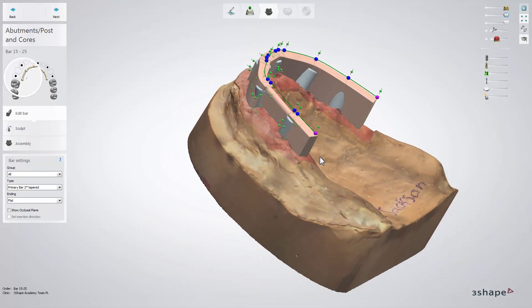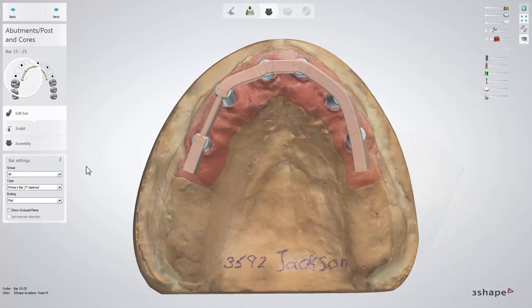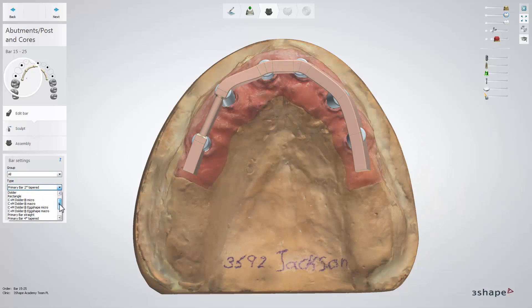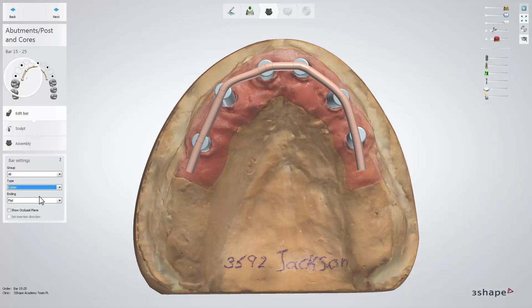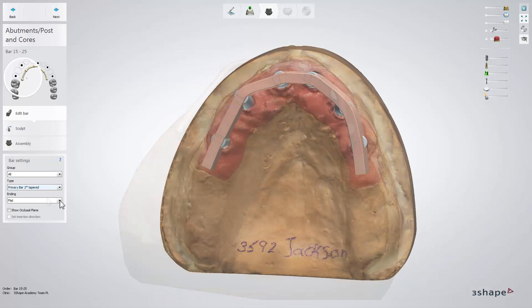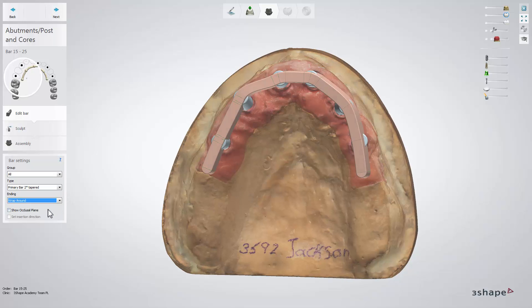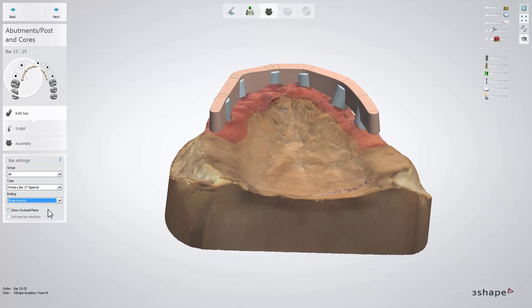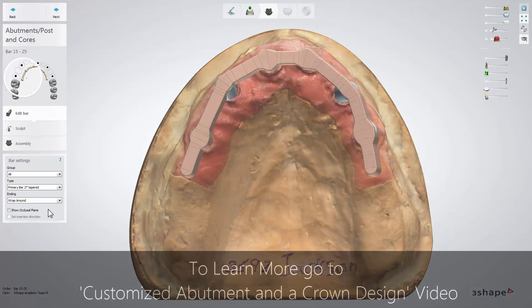If you want to change the bar type for the whole bar, go to the type drop-down list. Furthermore, the ending drop-down list allows you to switch between flat and wrap-around endings.